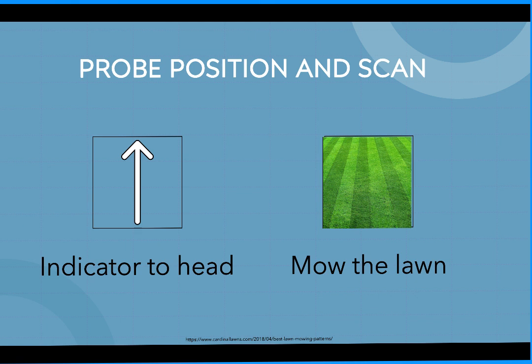Depending on what resource you use to study lung ultrasound, whether you're using different studies or different articles, they're anywhere from 3 points all the way to over 28 different lung points or zones. How are you going to remember which one to do? All you need to do is start by the sternum, either to the left or the right, and slowly go down, similar to how you would mow a lawn.